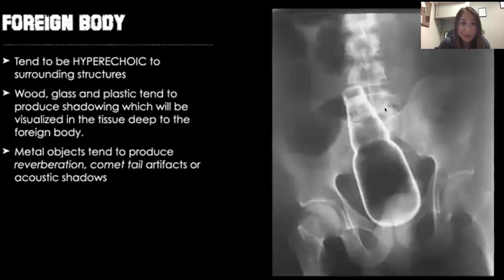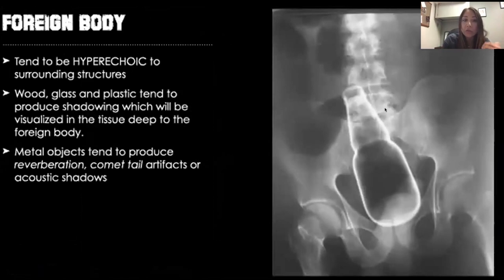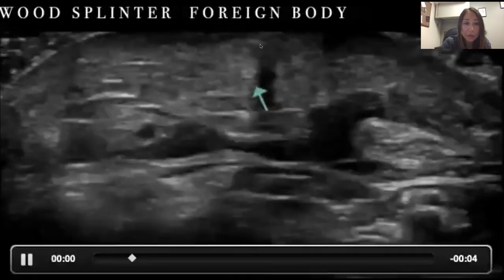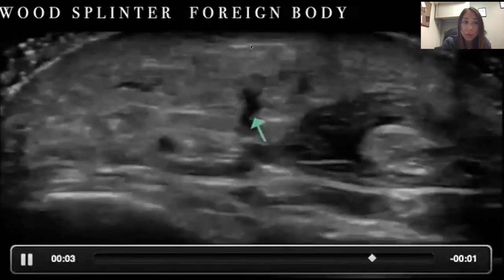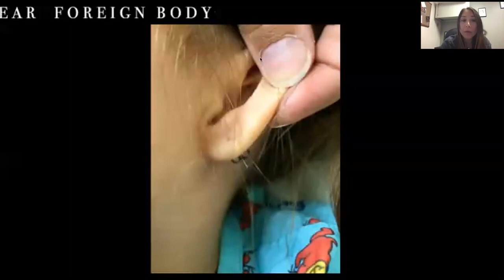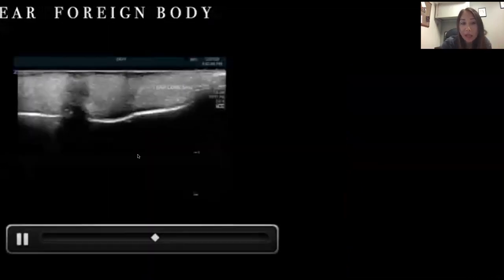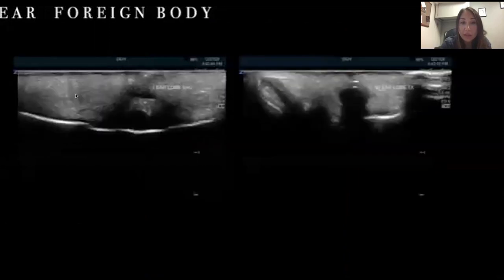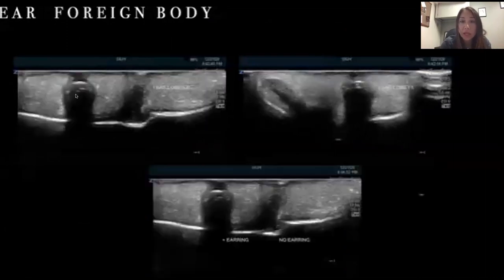Foreign bodies are a lot of fun to diagnose on ultrasound. They tend to be hyperechoic relative to surrounding structures. You can look for objects such as wood and glass — they'll sometimes cause shadowing deep to the foreign body. Metal objects cause reverberation or comet tail artifacts. This is an example of a wood splinter where you see the shadowing, and right above the arrow you can see the piece of foreign body. We had a patient with an earring embedded into the earlobe — the metal caused a reverberation artifact, and you can see how deep it is and use ultrasound to help extract it.